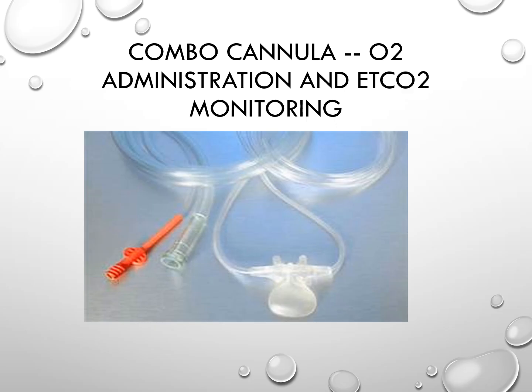And when an individual is given that, or is given patient-controlled analgesia, oftentimes they will be monitored with this dual device, giving a little bit of oxygen, maybe 1 to 3 liters per minute, and alongside that, their end-tidal CO2 will be monitored as well.